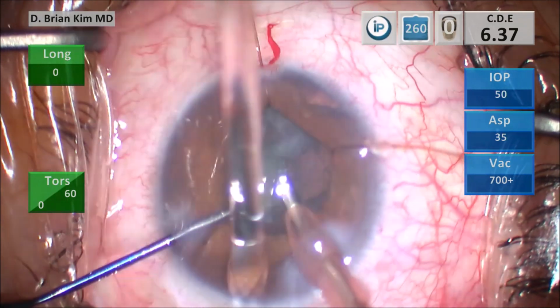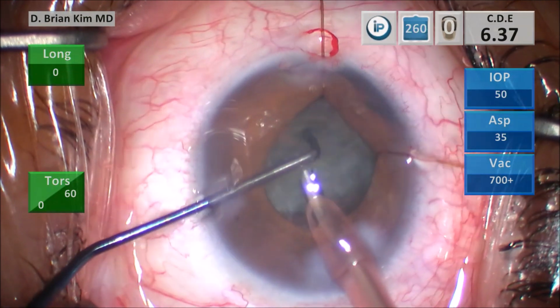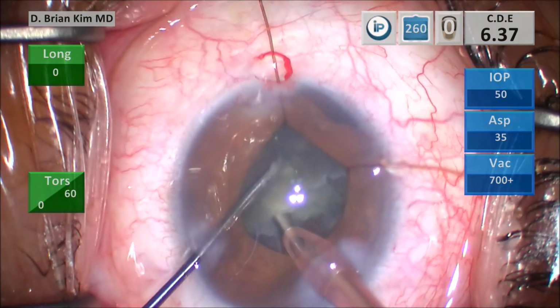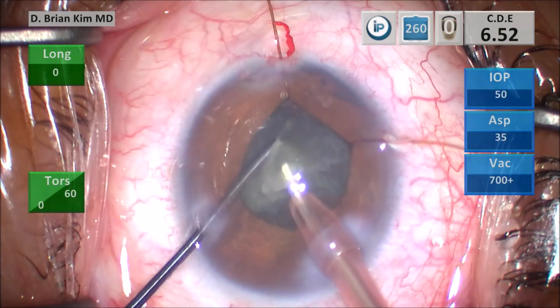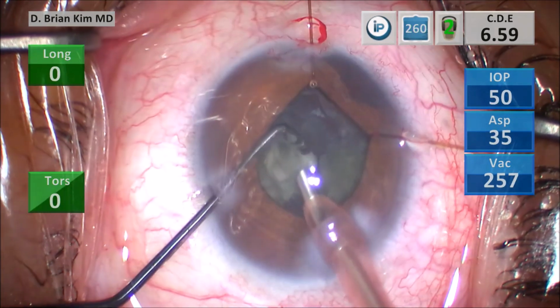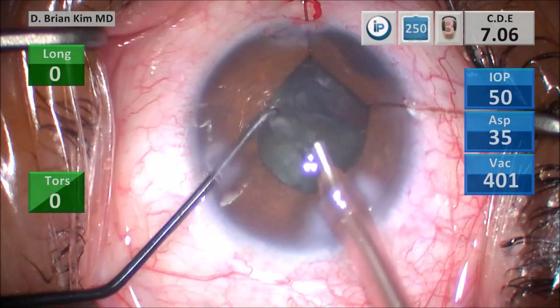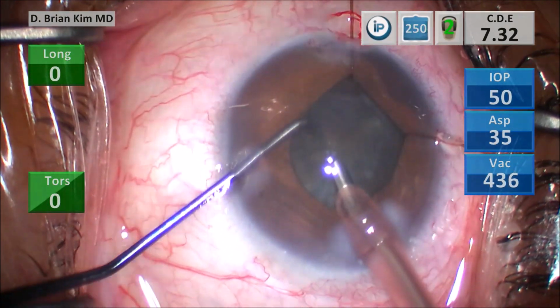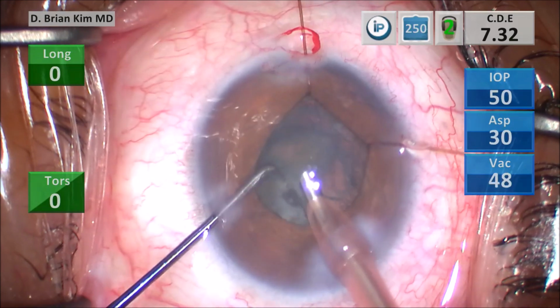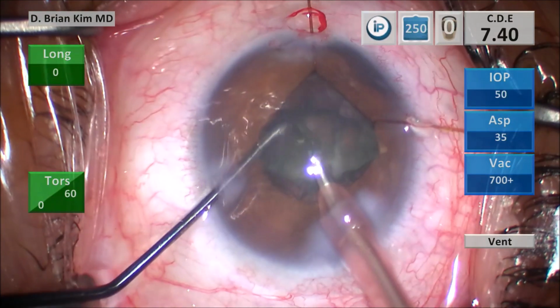And then I turned the second heminucleus in front of me, placing the chopper around the lens, hooking the peripheral lens and pulling it towards the center, crushing it against the phaco-tip. Doing the same maneuvers very carefully and in a controlled manner, crushing the lens into smaller pieces and then emulsifying the lens piece, using some vacuum to grab the fourth quadrant, and then again, getting the chopper around the lens, crushing it into smaller pieces, and then carefully emulsifying the lens pieces.